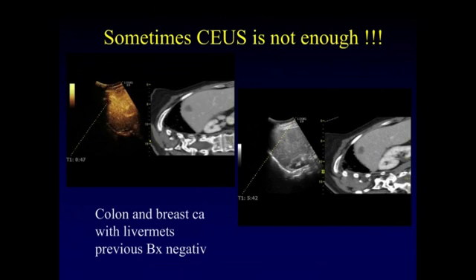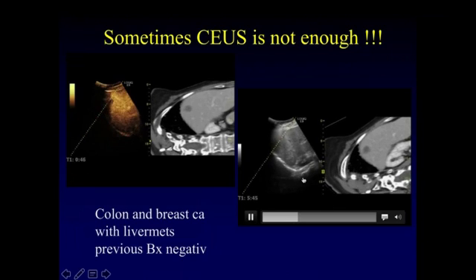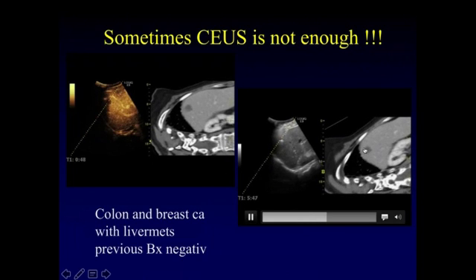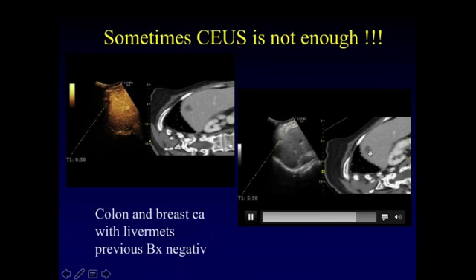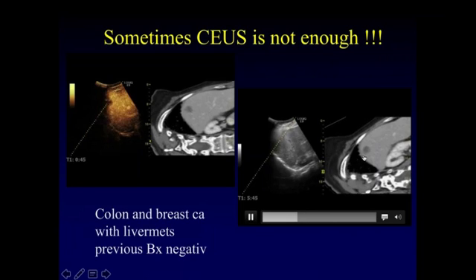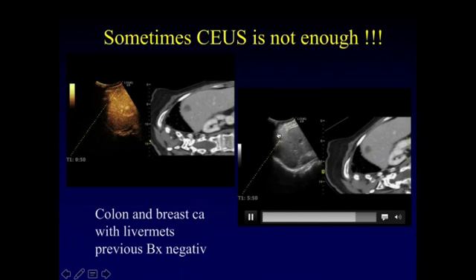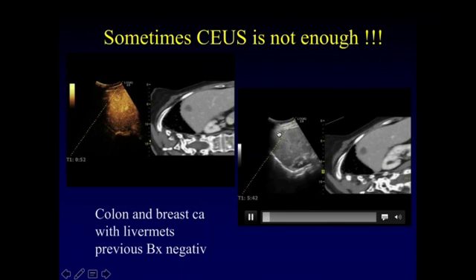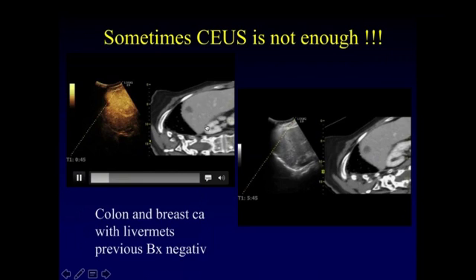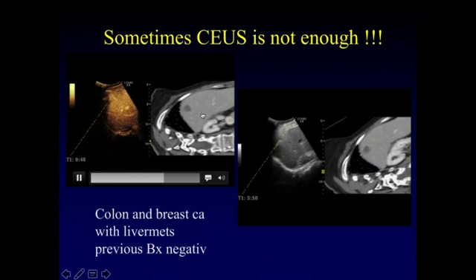Now, here comes a little of the fusion, because sometimes CEUS is actually not enough. Here we have a fused CT CEUS study, and here it's a fused CT B mode. You can easily see the lesion on the CT. You also know that these kind of lesions may be difficult because it's high in the dome of the liver, so the access can be very difficult. And indeed it is. With ultrasound, you have the pleural and lung interpose space coming down here, so you barely see the lesion. You know the lesion is up there. You can see it on the combined CEUS and CT fusion.